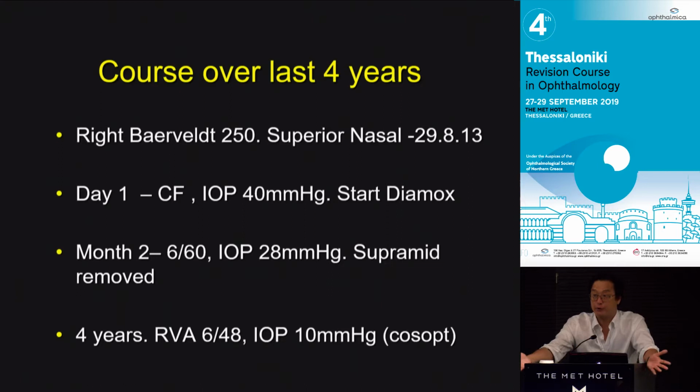Or if you don't have an Ahmed valve, you only have Baerveldt, I would definitely put a smaller one rather than a big Baerveldt. Do you use Ahmed valve or Baerveldt here? Both. Great. So you have both, yeah. But with the Ahmed valve, you do have to test it before you implant it because sometimes they don't work at all. And we published it a few years ago. And that's it, actually. Pan, do you want to take over?